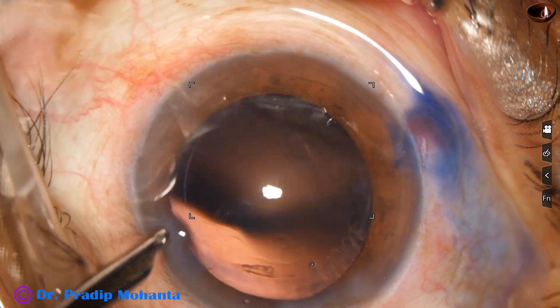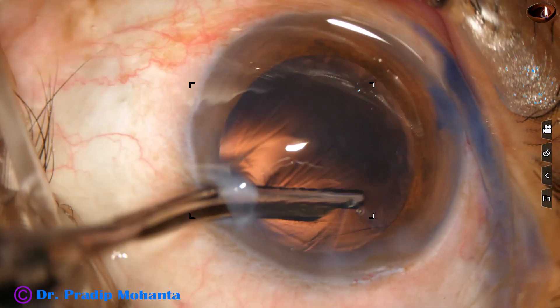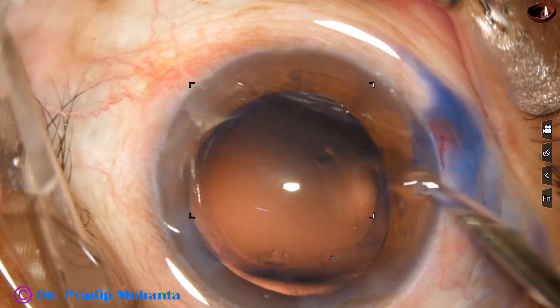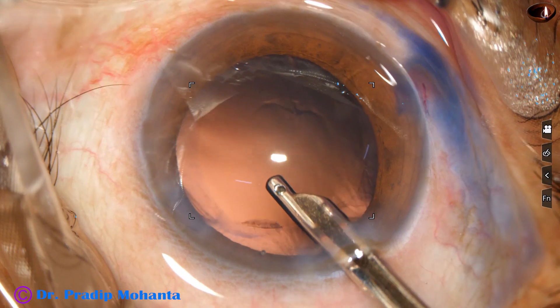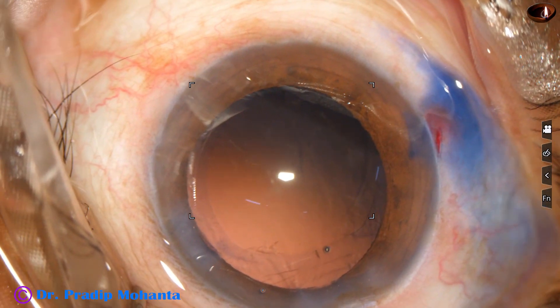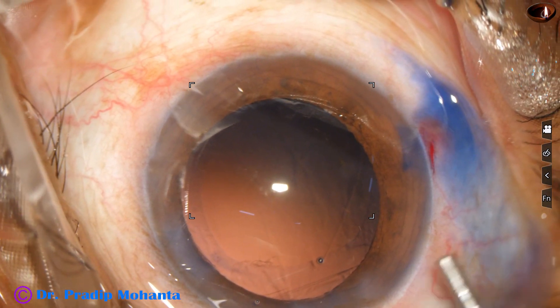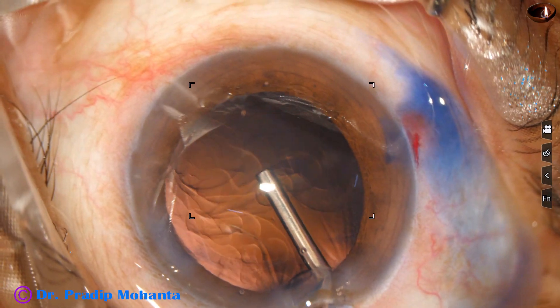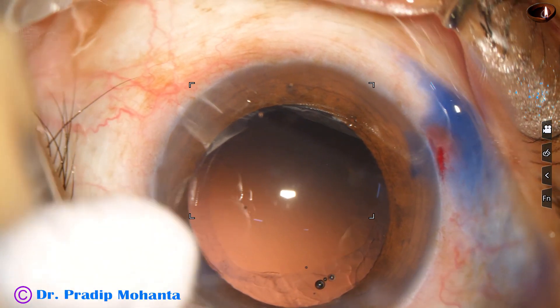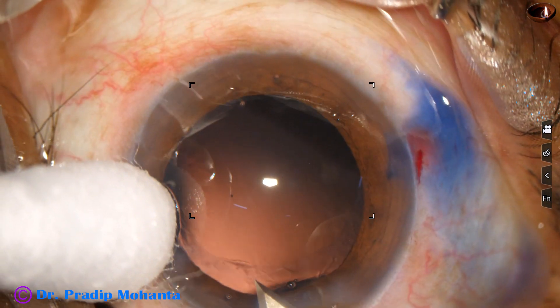This side port is small. I have caused zonular dialysis for about one and a half clock hours from 11 o'clock to 12:30 o'clock, but I am not going to put a stitch here. I am going to manage this by the haptic of the intraocular lens.